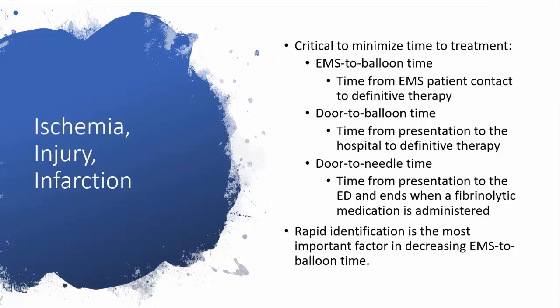Now, you're not always going to have fibrinolytics, or affectionately called clot busters, and you're not always going to have definitive therapy, but that is not for us to decide. We just must perform the steps to make sure the patient has the best chance. Rapid identification is the most important factor in decreasing EMS to balloon time, and might I add that rapid identification with confidence in yourself and your ability to interpret this is going to be very important.